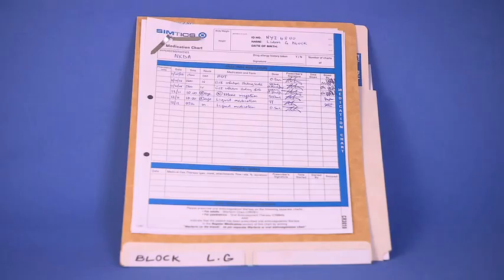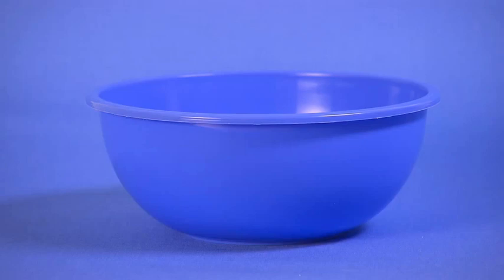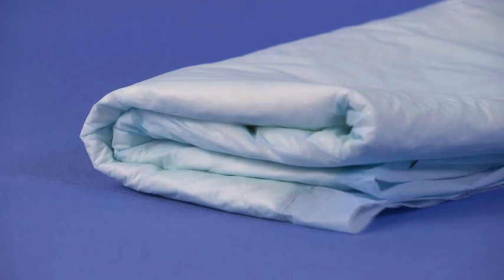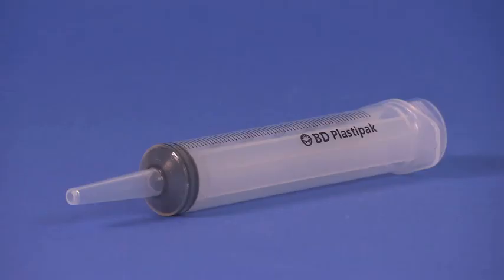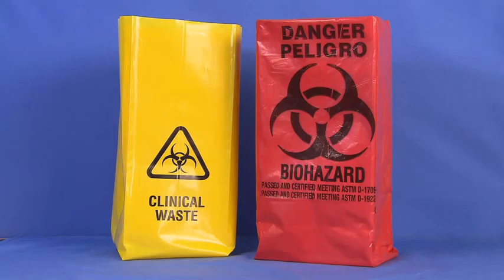Equipment required includes the following: the physician's written order, irrigation solution, a jug and a round basin for irrigation solution, an otoscope, towels, disposable drapes, a drainage basin, sterile gauze swabs, a syringe for irrigation, prescribed ear drops, cotton balls, and gloves.